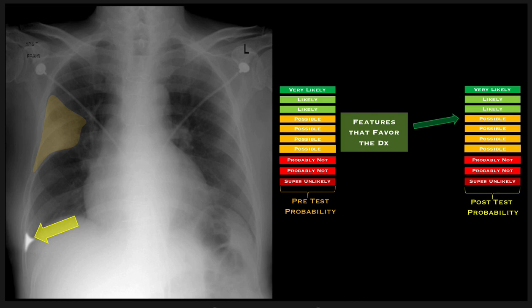It's nice when you can see it, but you can have a pulmonary embolus with a normal chest x-ray. The chest x-ray appearance for pulmonary embolus is usually stone cold normal, maybe a little bit of a non-specific pleural effusion, that you're going to bias yourself with clinical history, and the correct first step is not a chest x-ray. It's a CT angiogram timed to the pulmonary artery, CTPA.